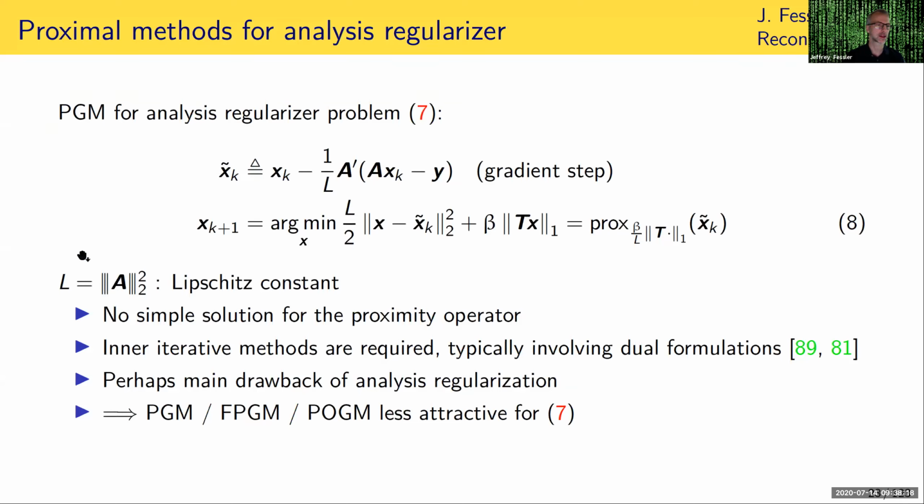As I mentioned, this is the classical version where you put the Lipschitz constant here, and how easy that is to compute depends on your application. In single coil MRI, this is easy. In multiple coil MRI, it's a little bit harder, especially in non-Cartesian parallel MRI.